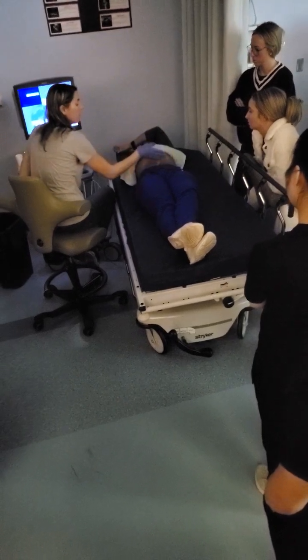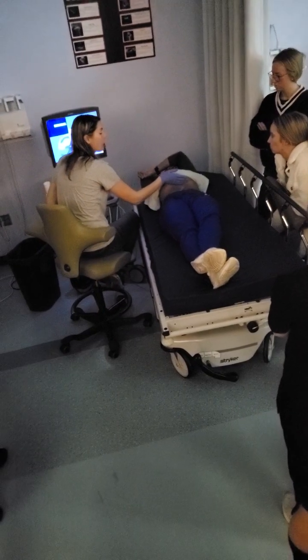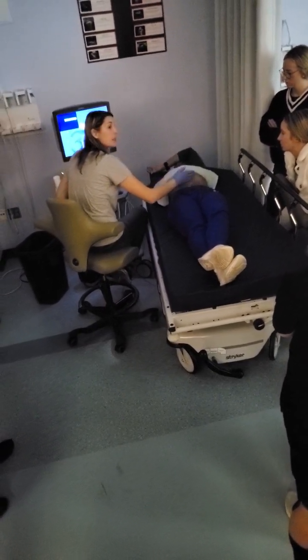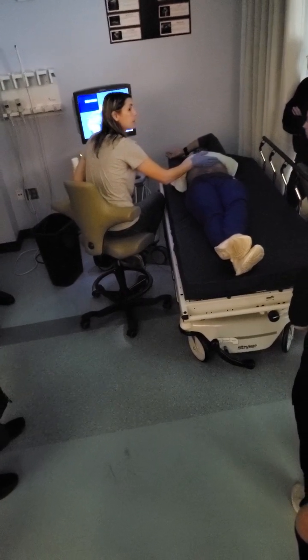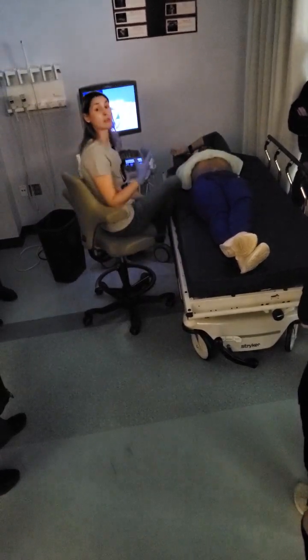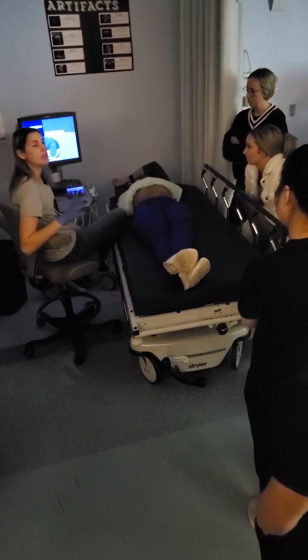Now our main portal vein, we scanned at about 10 o'clock. It's going from the mesentery over to the liver. Our pancreas is going to be the opposite. It likes about 7 o'clock. So we're going to find that portal splenic confluence. And what are our other landmarks? If we can't find our pancreas, what are some other landmarks we can find? Who's it connected to?